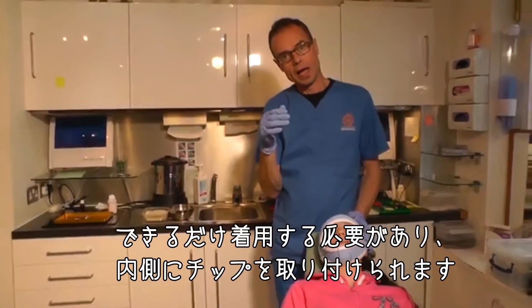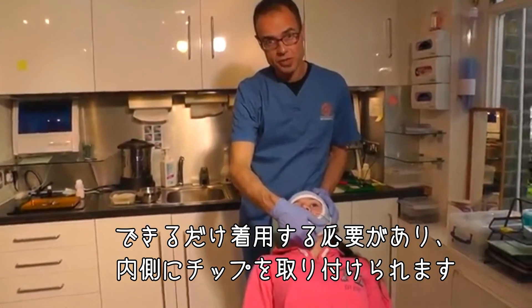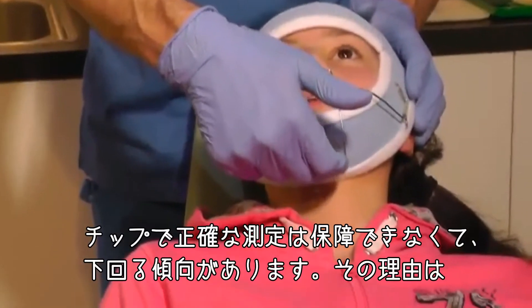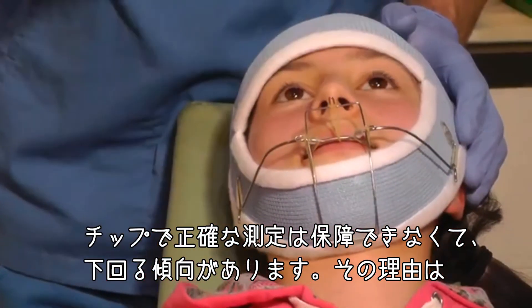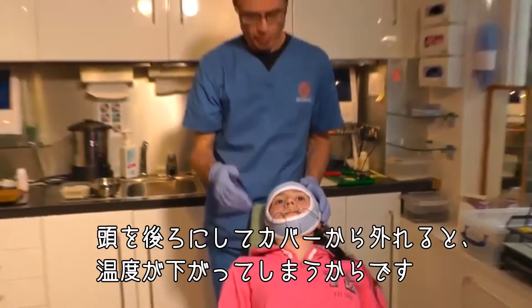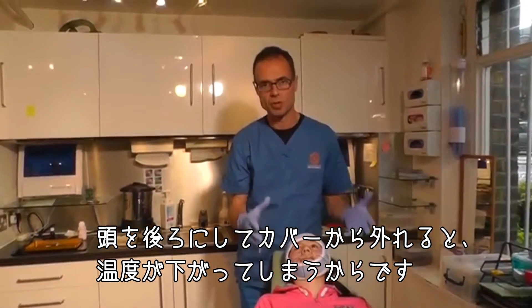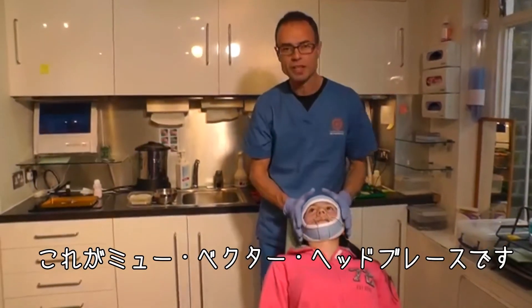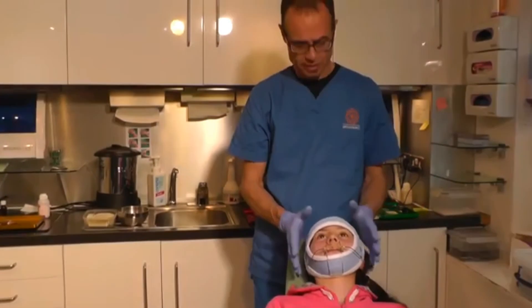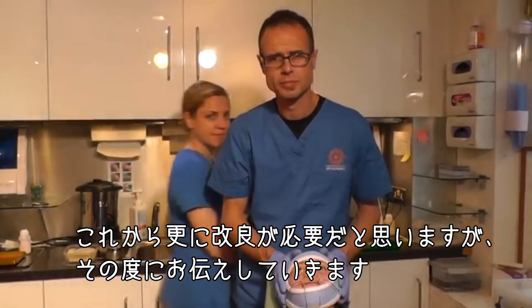It needs to be worn consistently. There's a compliance chip placed inside — that chip won't always give you a perfect reading; it tends to under-read because if someone leans their head back out of the covers the temperature drops, giving an under-reading. Basically, this is the mu vector head brace, and I'm sure we'll modify it more, but we'll keep you updated.